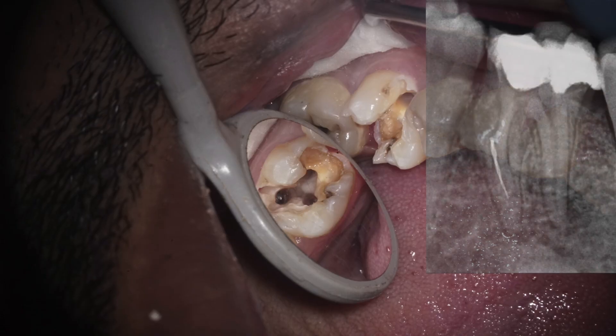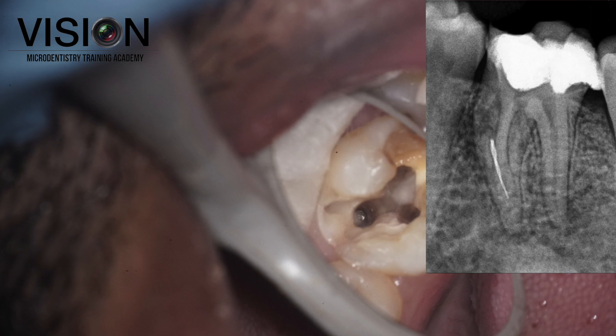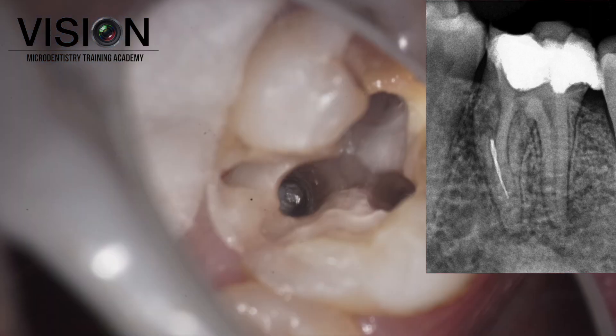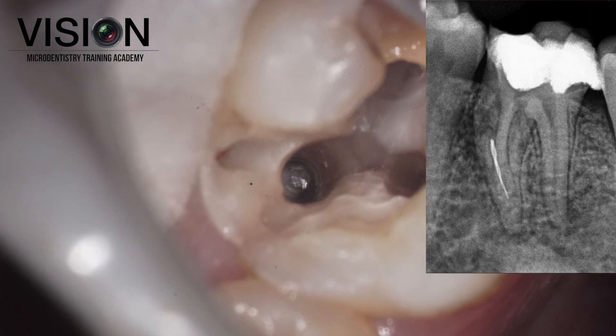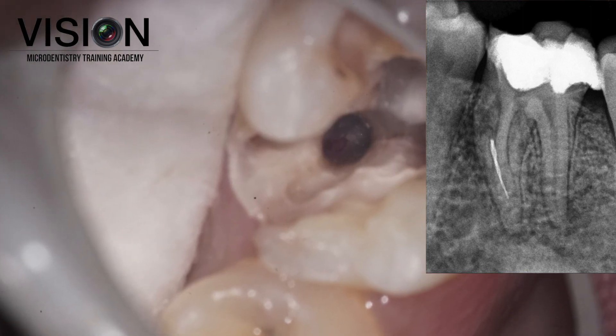This was the pre-operative situation that the patient came with. He was referred to me for retrieving this broken instrument which was treated by another dentist. Unfortunately, he also tried to retrieve the instrument without any magnification and it led to a small perforation internally.